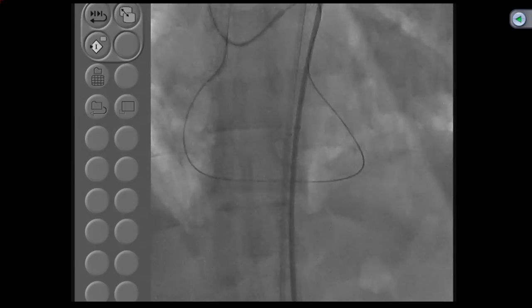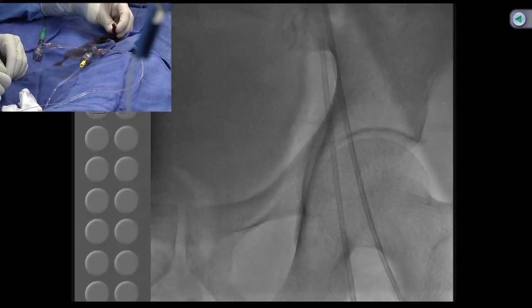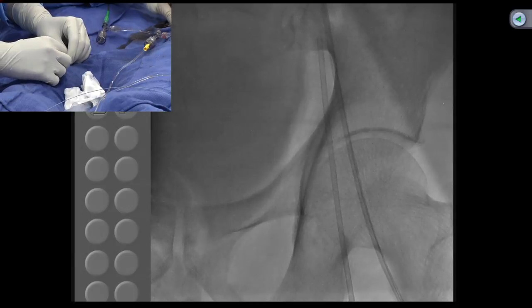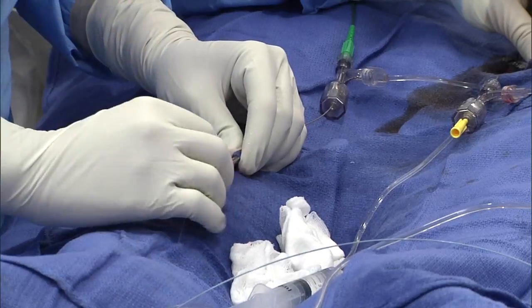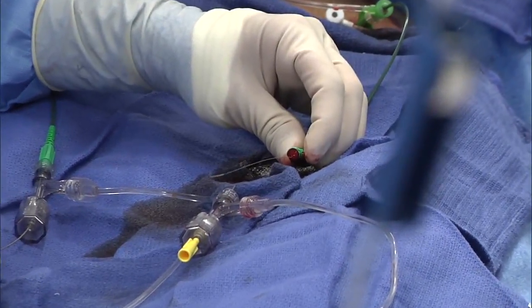Make sure the guides are all good. It has to come out now. Good. Advance a little more. Okay, good. See that wire has come out now? Now put it into your... and focus there. And there we see it coming.